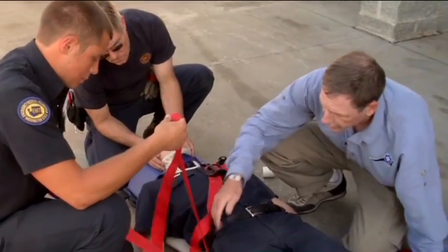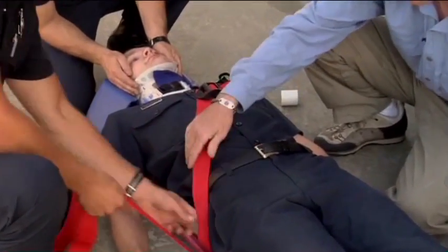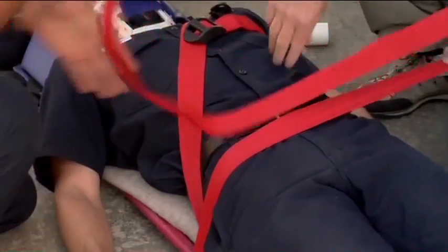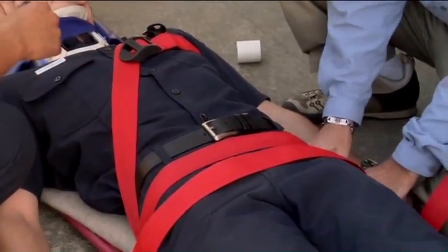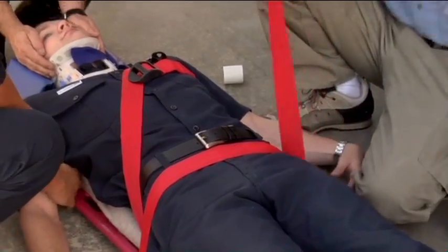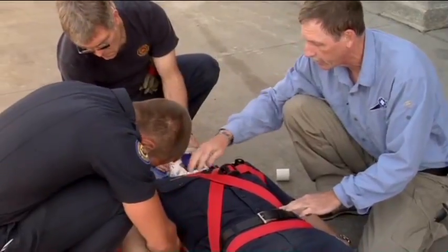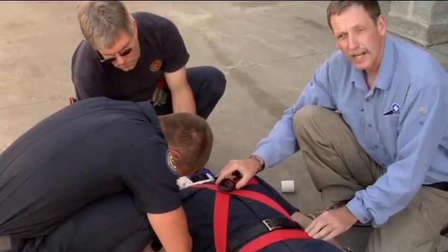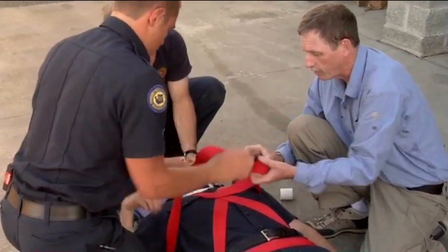So what Chris has done here is he's gone down and he's found the bony portion of the pelvis, and that's his landmark for adding another strap board contact. That's perfect. Now we're going to go across, find the other wing of the pelvis, make sure we catch that. And then we're going to bring this back up over the shoulder, which creates our second deceleration strap. And then we're going to pass it through a hole in the board and bring it straight back across.